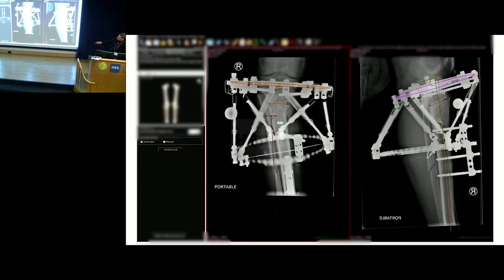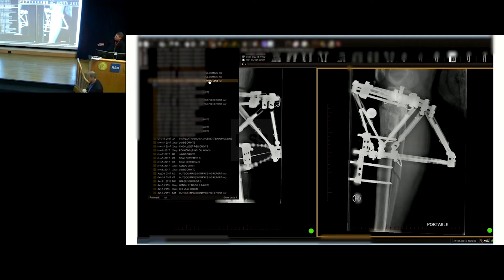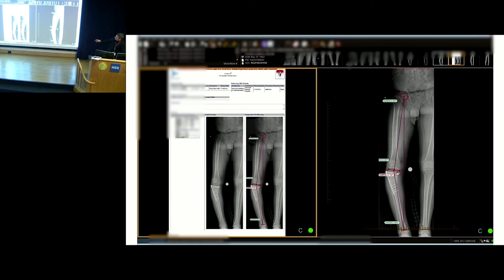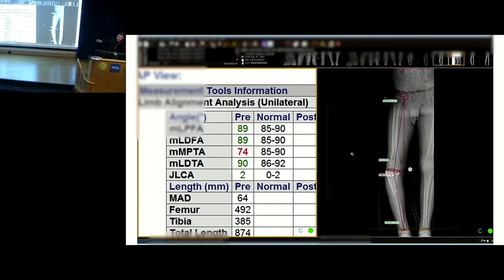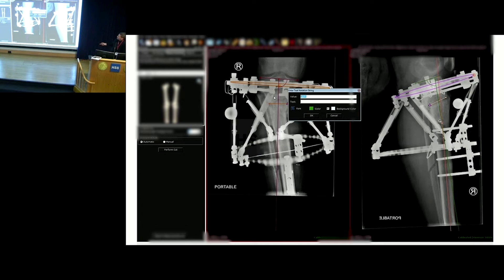We do that same thing on the AP. I will choose my MPTA based on preoperatively what the LDFA is, assuming there's no intra-articular joint laxity. So I'm going back to the original — this patient has an LDFA of 89, so I'm going to choose an 89-degree MPTA because I want an MAD of zero.